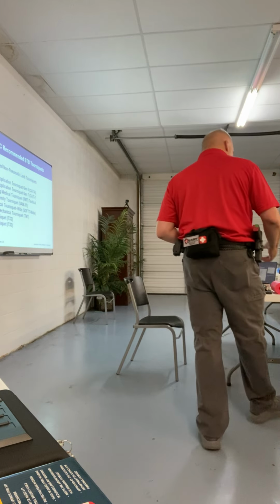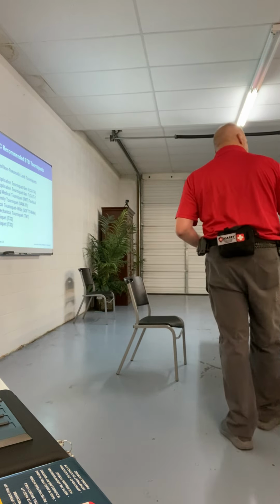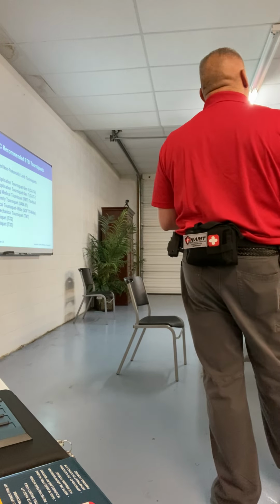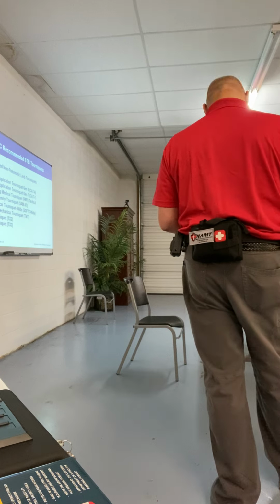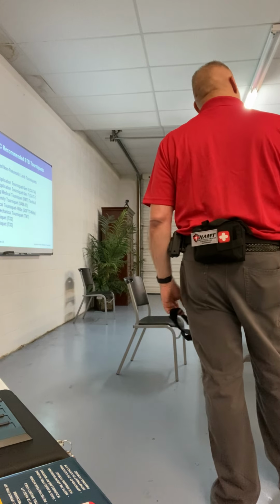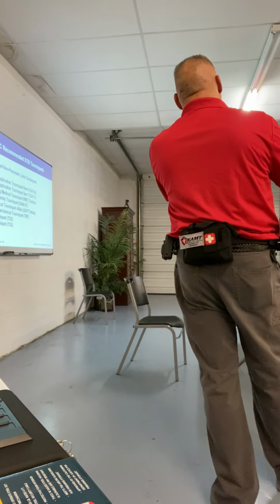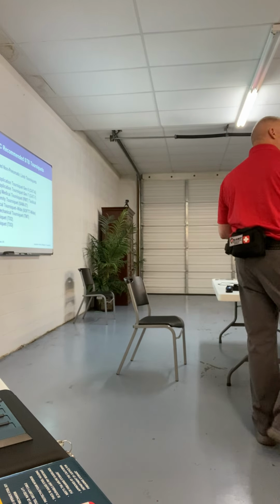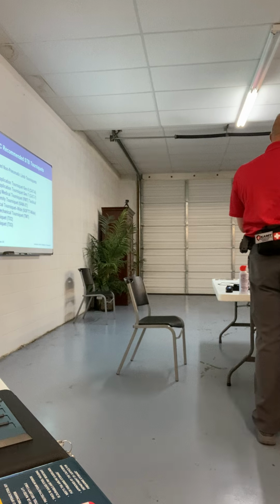There was another company that I really liked, and I say liked because they are now going out of business, because they copied the Cat tourniquet so well that they're getting sued. The way theirs is different is they have a Kevlar windlass. If you know Kevlar, you're not going to break Kevlar, so you will never break that windlass. The other reason I like it is they have a pen inside of the windlass. That makes sense.